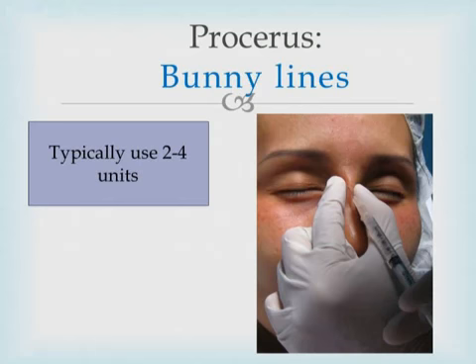The technique here, to prevent it from diffusing further laterally and then to the orbicularis oculi, is that I fold the skin up and inject inside the muscle.